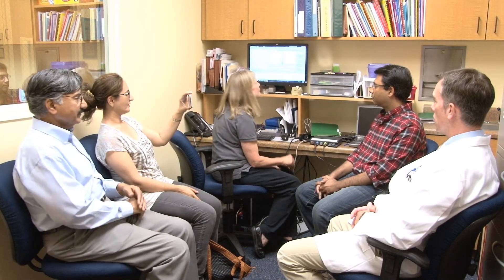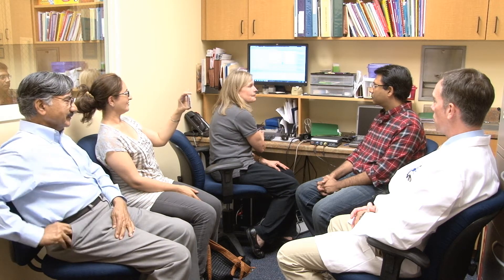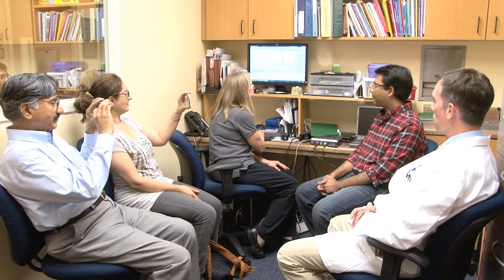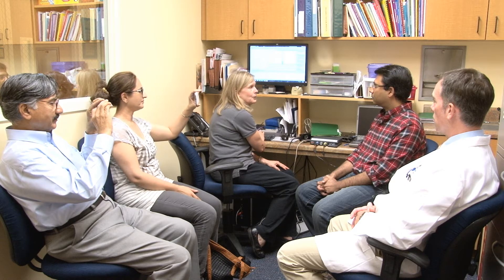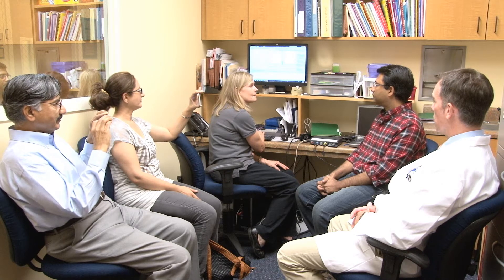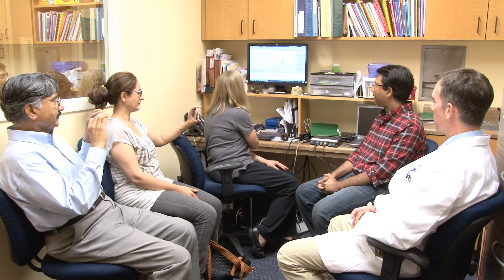It's not very loud. Okay, and I'm going to make it louder. Do you hear it getting louder? Yeah. Is it too loud or good? No, it's too loud. Okay. Still okay? Still okay? All right. I think that's fine. Do you like it louder, or do you think that's loud enough for now? I think it's good for now.